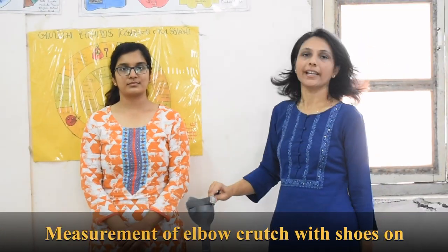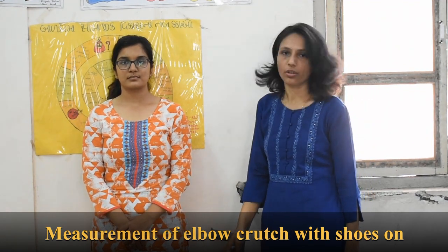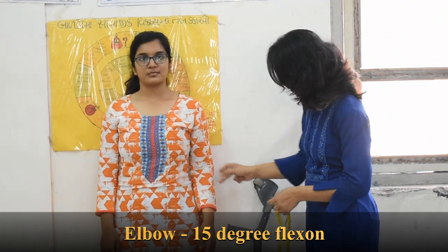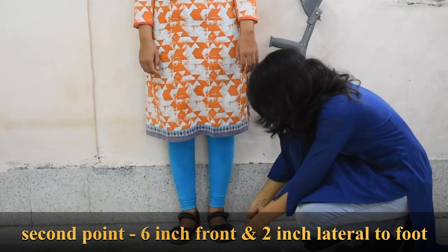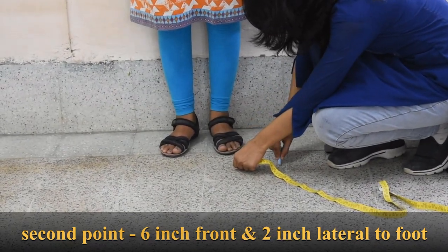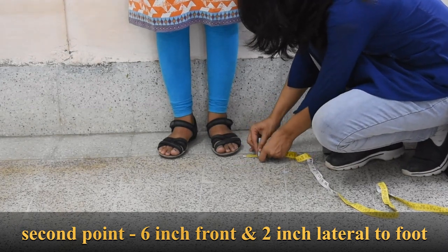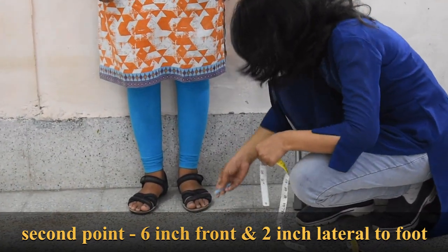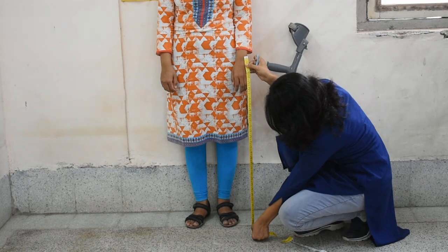For the measurement of the elbow crutch in standing position with shoes on: in this position you are going to put the elbow in slight flexion, that is 15 degrees of flexion. The first point is the radial styloid process, and the second point is 6 inches in front and 2 inches lateral to the foot. From the radial styloid process to this point, you take the measurement. Here it is 33 and a half inches — that is the measurement for the elbow crutch in standing.